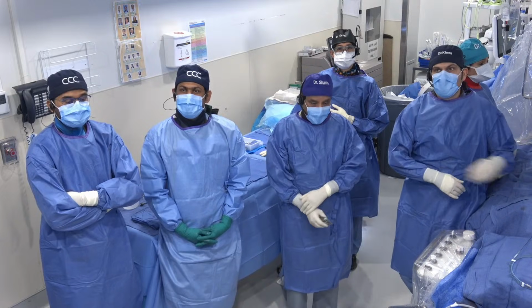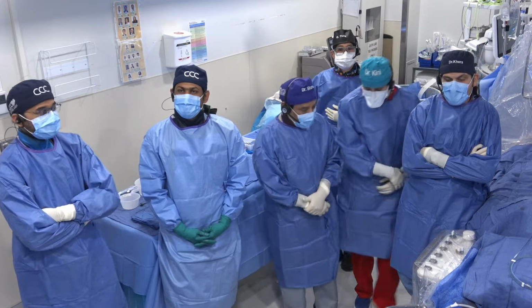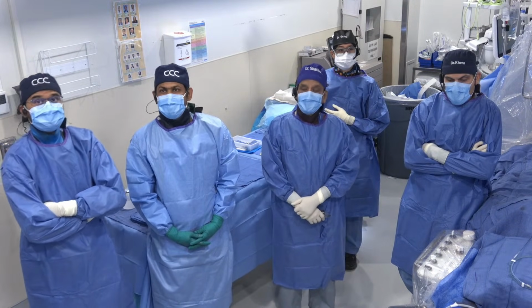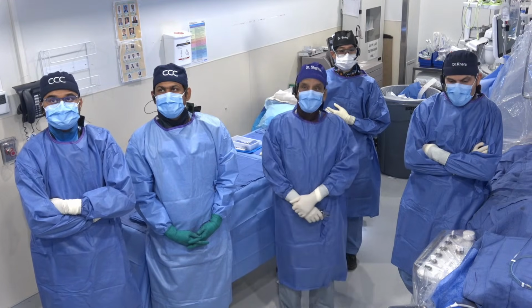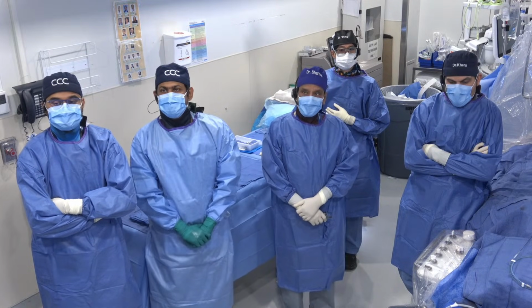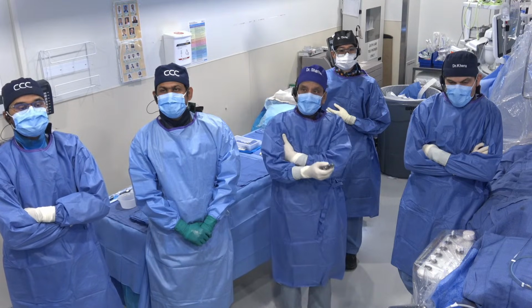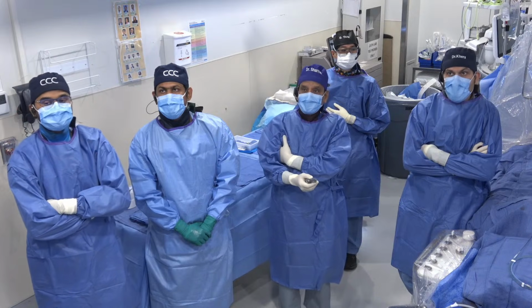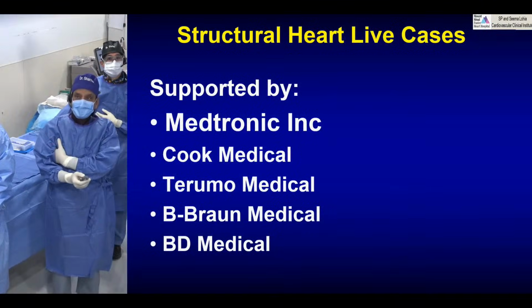With that note, as you know, initially we discussed whether we should do a live case or not. But we want to keep our pattern and not change it. I will say that we are creatures of habit. We want to keep it the same way, and that's why we are doing it. But we still want to make a point about small aortic annuli, which is happening quite a bit nowadays with the patients who are coming in, and that's the case we are going to show. And we have 8-9 structural cases for Thursday. With that note, let me present our slide presentation.